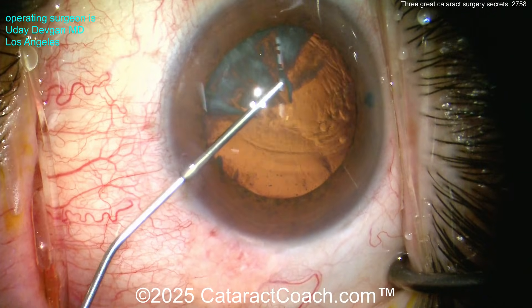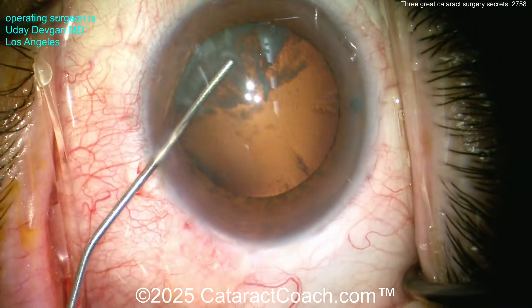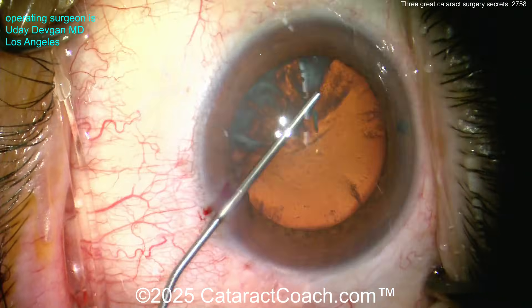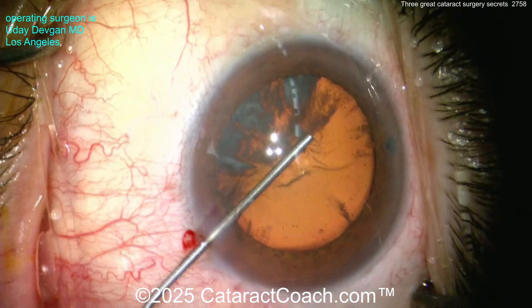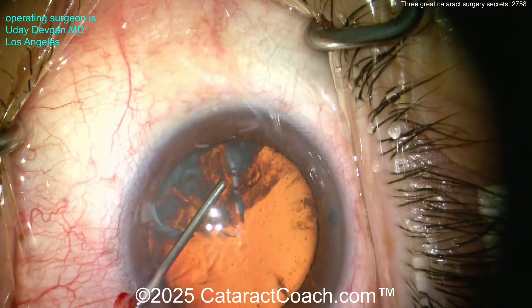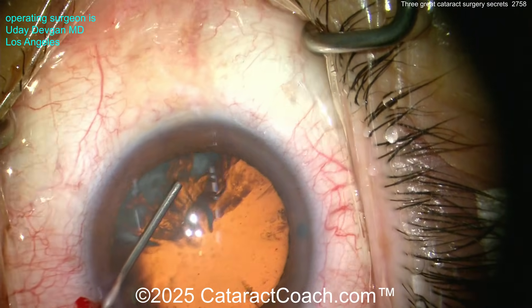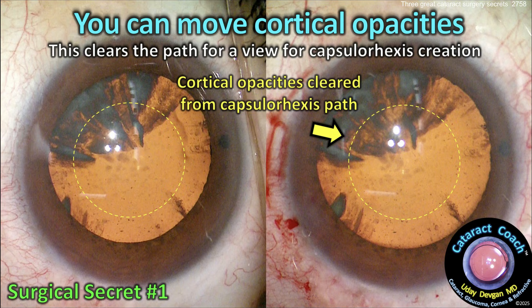Did you know you can actually move those cortical opacities out of the way? Using the blunt cannula — that's just liquefied lens cortex, so you can move it and clear a path. Before doing the capsulorrhexis, on top of the lens capsule, put your viscoelastic and use the cannula to gently brush away and move those cortical opacities away from the path of your rexis.